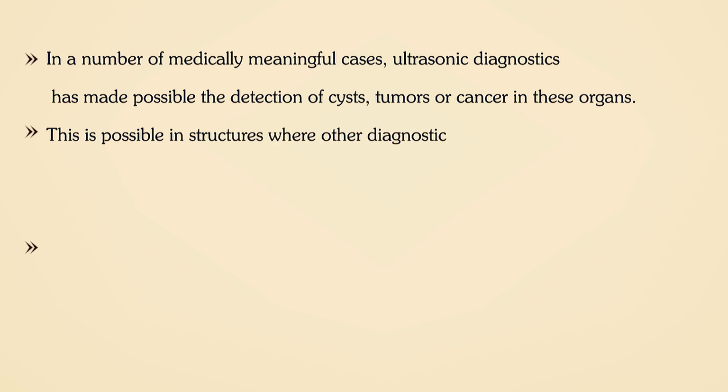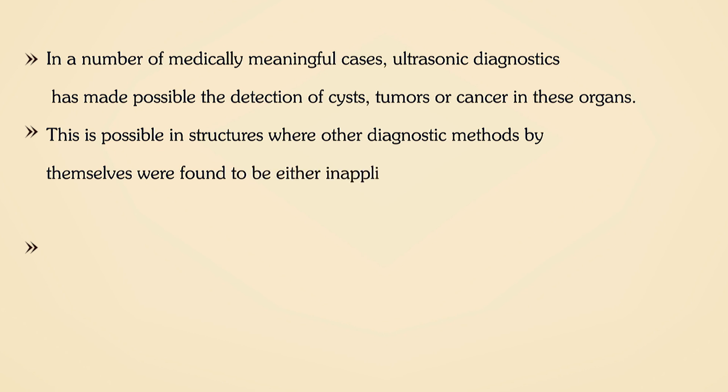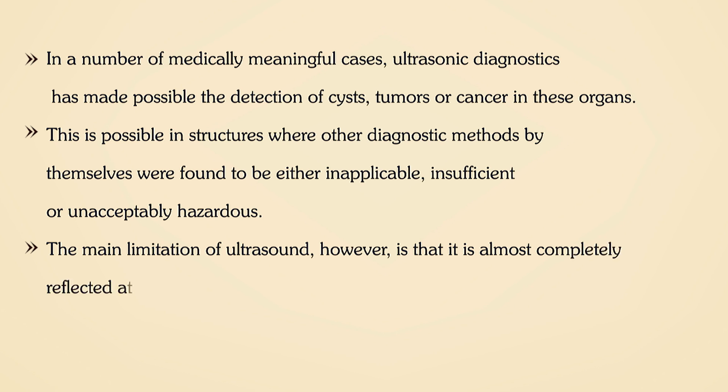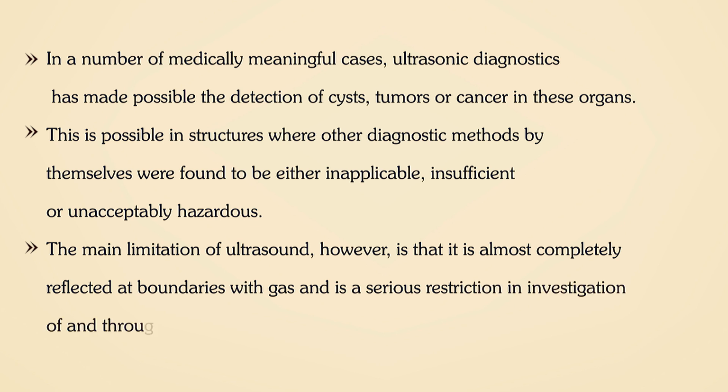Ultrasound imaging is possible in structures where other diagnostic methods by themselves were found to be either inapplicable, insufficient, or unacceptably hazardous. The main limitation of ultrasound, however, is that it is almost completely reflected at boundaries with gas, which is a serious restriction in investigation of and through gas containing structures.